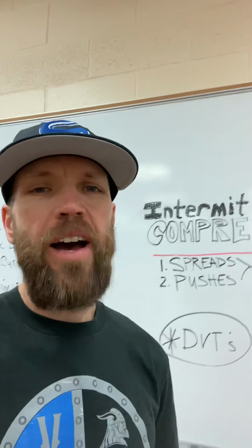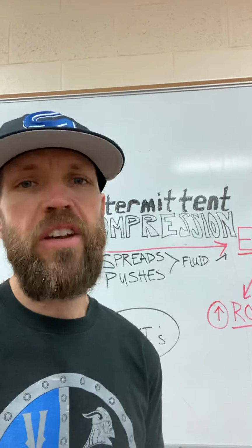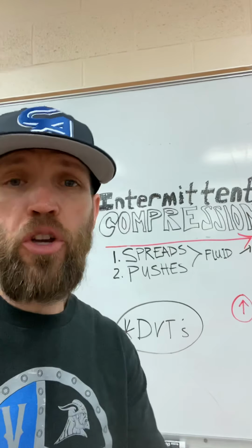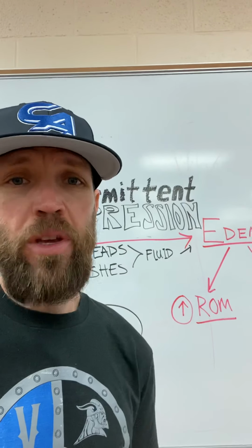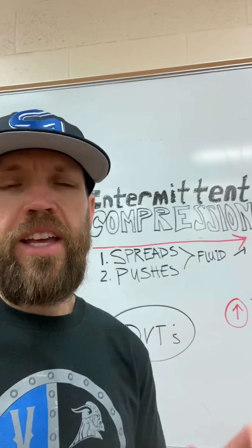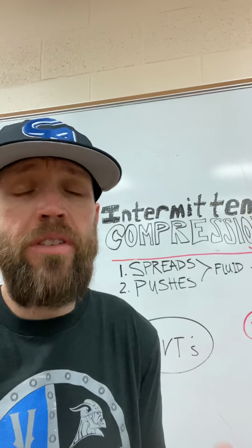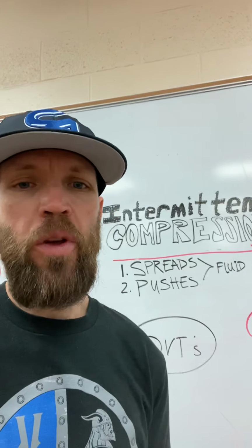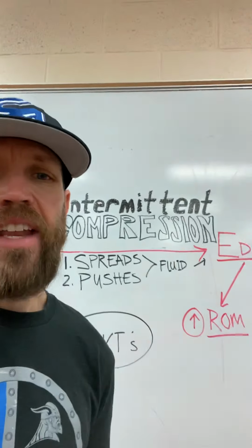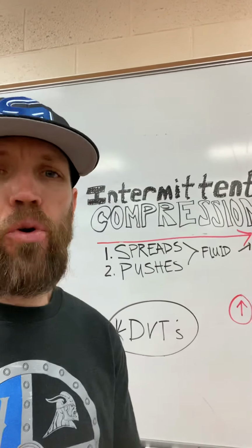We're going to be talking about primarily the two principles that are driven from intermittent compression. We're going to show you some tools and then actually turn them on and show you how we use them here. But number one, we have to understand that principle of intermittent compression. Why is that used? It's actually called intermittent pneumatic compression, so there's air with that. But we use that, and you can see right here on the whiteboard behind me, to spread and push fluid.